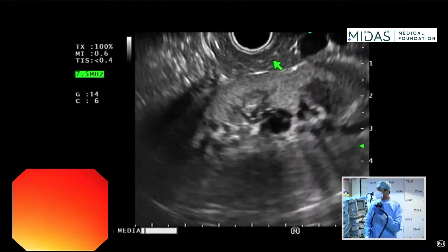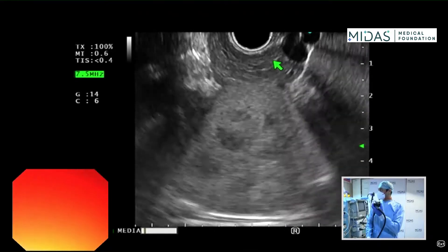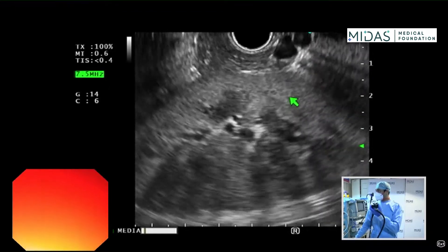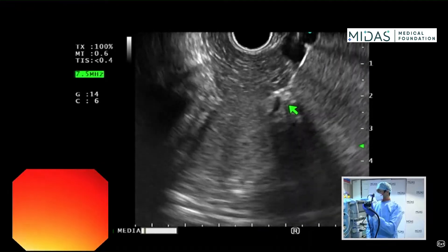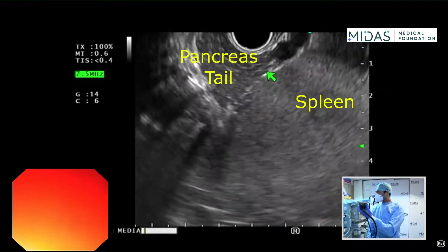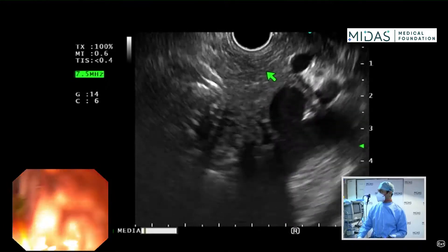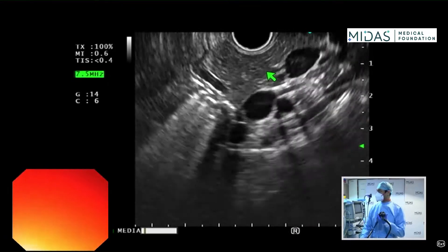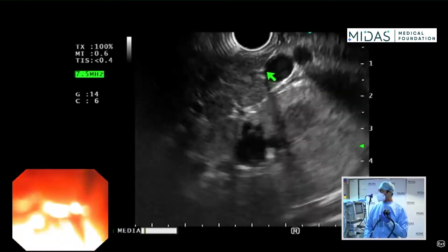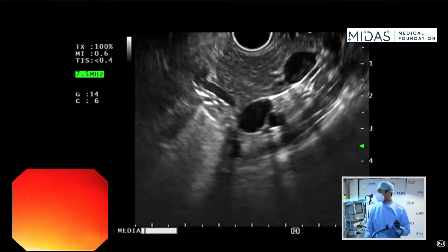Continue with more clockwise torque and pull the scope back a little. Now what you start seeing on the screen is the spleen, pancreas tail, and kidney. Keep doing counter-clockwise and clockwise to visualize the entire pancreas — the neck, body, and tail region — going back and forth to see the pancreas in all planes.